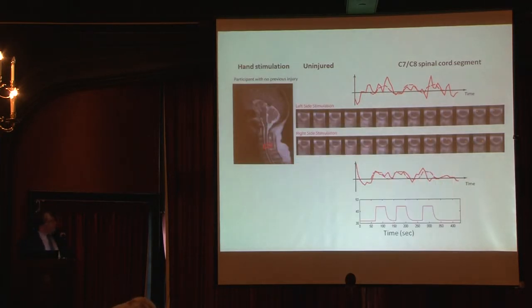Now here's our time course pattern we're looking for. Each of the 4 areas we stimulate gets a different pattern in time that is distinct, so we can identify each of the 4 responses. And we know they're not going to be limited to one particular dermatome, they're going to spread up segments and into brainstem regions. So here's our average time course response just for these areas colored in here.